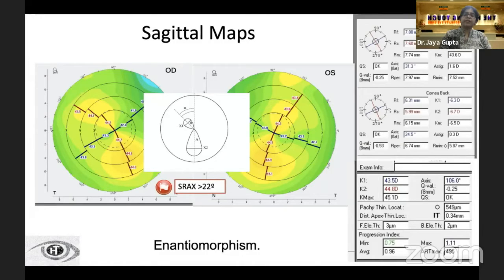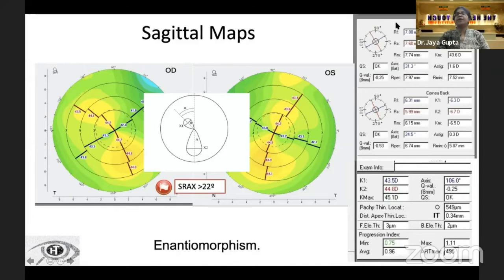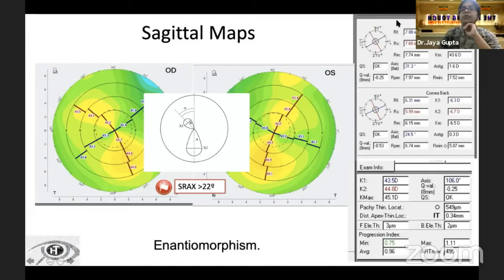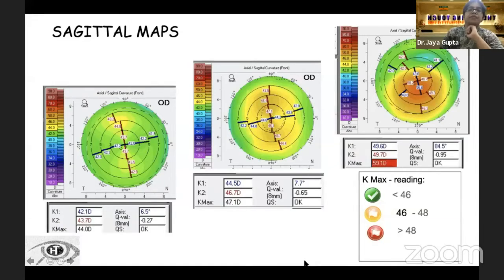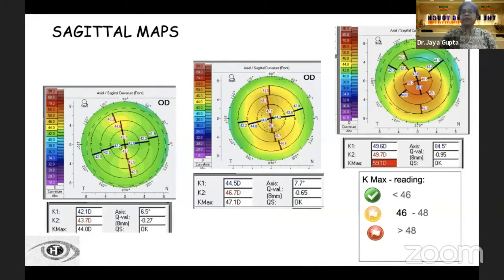Borderline irregularities that mirror in both corneas — called enantiomorphism — can be accepted. The keratometric values include K1 (flat K), K2 (steep K), and M (mean keratometric power). We also have Kmax, which is the maximum keratometric power on the anterior surface of the cornea. On the sagittal maps, a Kmax value beyond 48 diopters is a red flag.